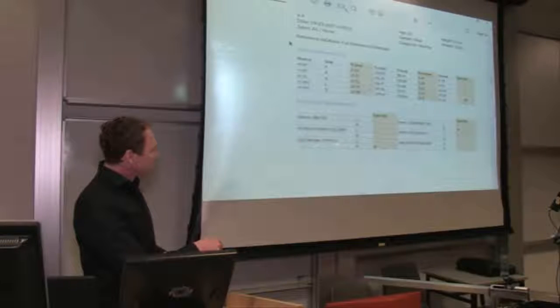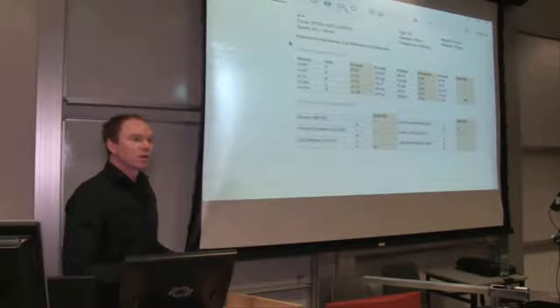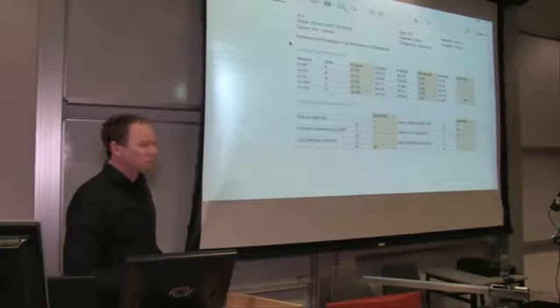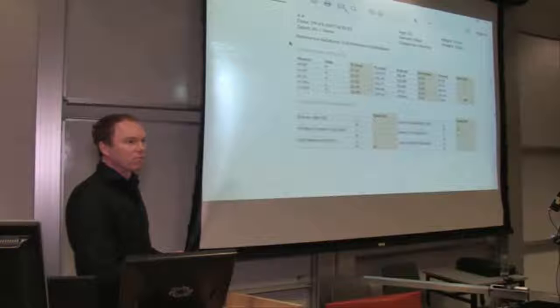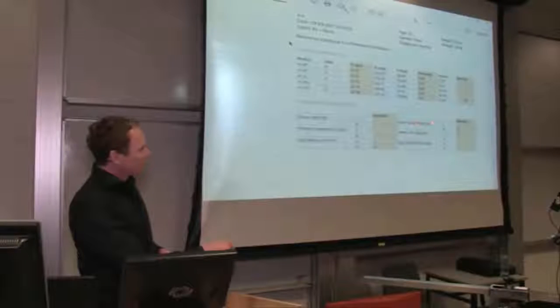For the patellar ligament symmetry, in which the lateral and the medial quadriceps heads are combined, 91% symmetry is recorded, which is quite good, I would say. So we have 22 milliseconds here and 22 something here. So the symmetry is very good from that point of view. Knee symmetry, in which we compare the combined result of all three quadricep heads to the biceps femoris, again, it's 91.